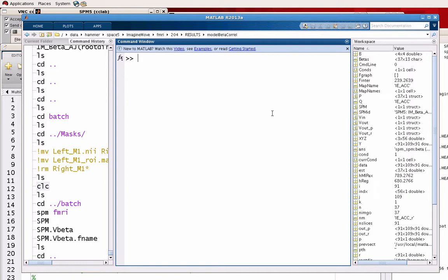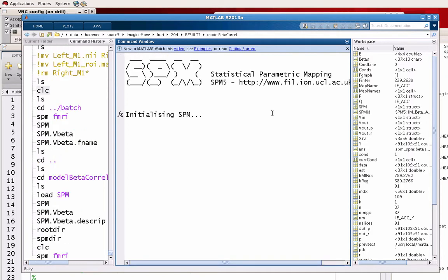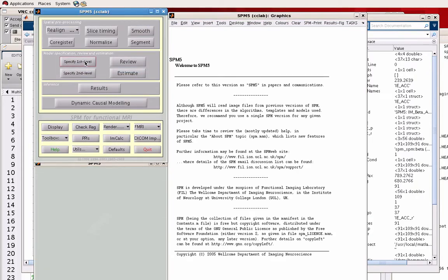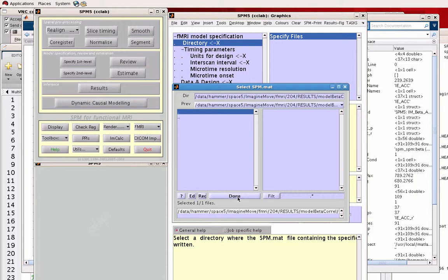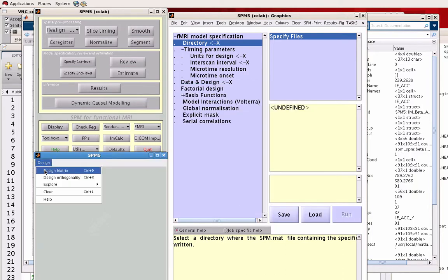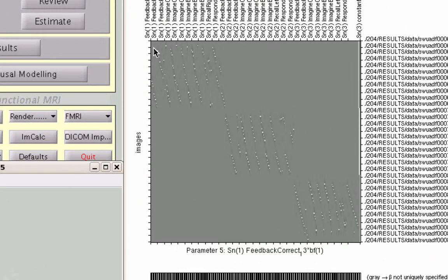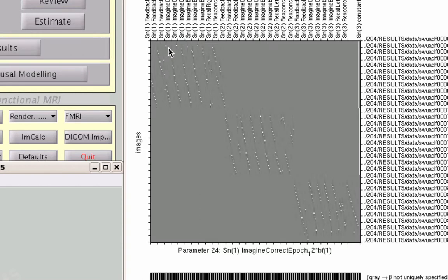Let me show you how it gets set up. What I'm going to do here is open up SPM and show you what this design matrix looks like in one of these subjects. So if we go to review, I'm in a subject's directory which has already been set up and estimated, but we're just going to look at its design matrix. Notice what I've done is I've actually estimated a beta individually for every single trial and every single regressor. You wouldn't need to do this for every single regressor — you could just do this for the regressor that you're interested in, just take the betas for that specific regressor. But in this case, we've done it for all of them. Notice at the very bottom, as I'm scrolling across here — I'm just holding down the right mouse button going across the columns — you see there's an index that increases. So that's the number of betas as I'm going across here.